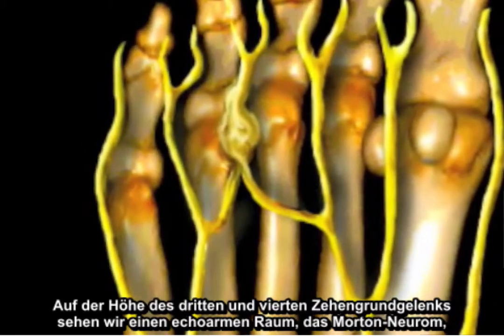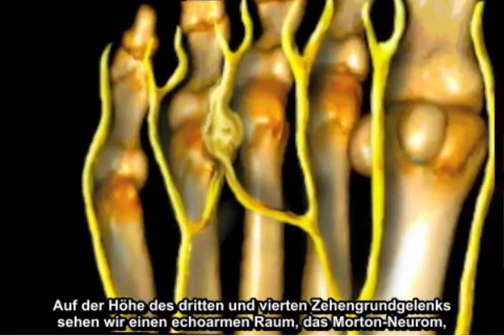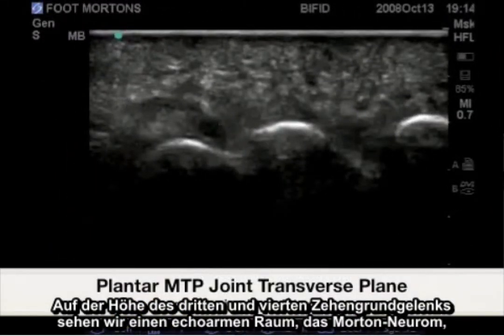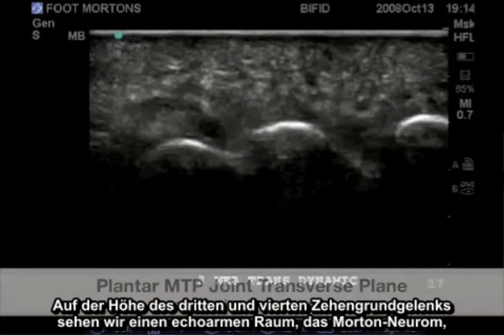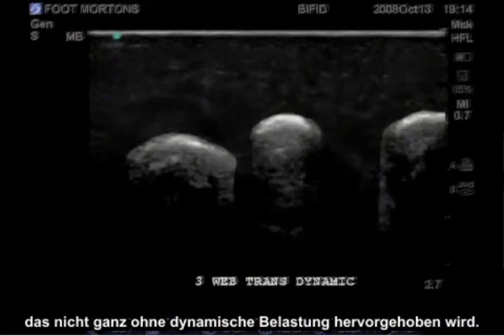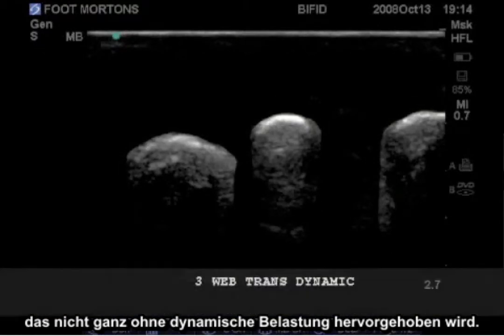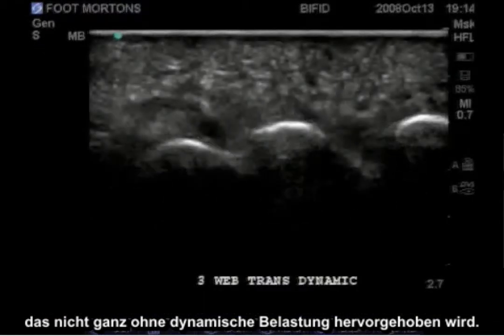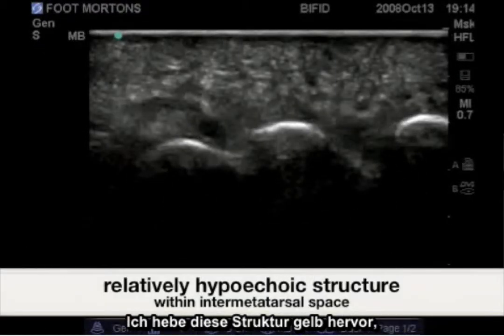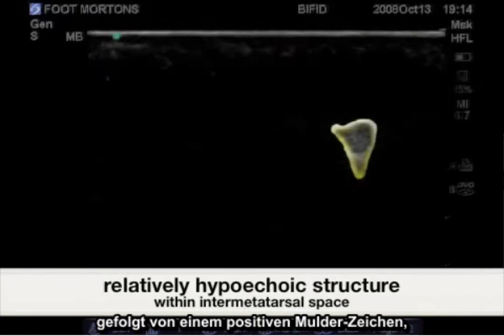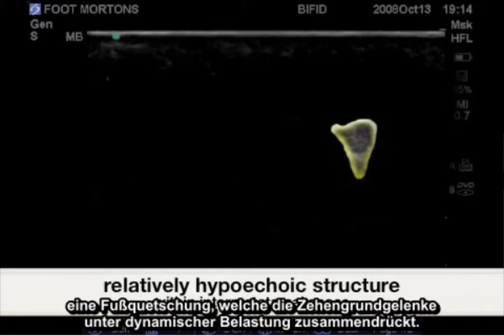At the level of the third and fourth MTP joint, we see a hypoechoic space representing a Morton's neuroma that is not quite accentuated without dynamic stress. We'll highlight this structure here in yellow, followed by a positive Mulder's sign.